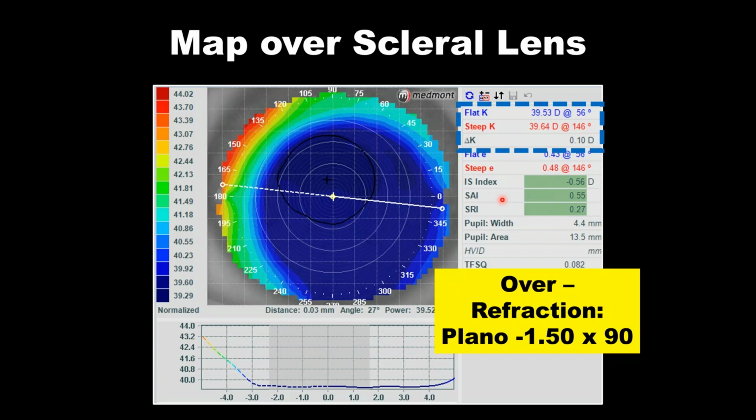That's a lot higher than we would see in corneal GPs, and this isn't really clearly understood. Why is it that the scleral patient more often needs some kind of toric optic where the same patient in a corneal GP wouldn't? But it is what it is, and we haven't figured out the answer to why we need these front torics. So in a scleral, what do we do when it comes up in these 15% of cases? Well, one thing we have to understand is the contact lens flexing. Is that lens bending on eye, and that's inducing the cylinder?